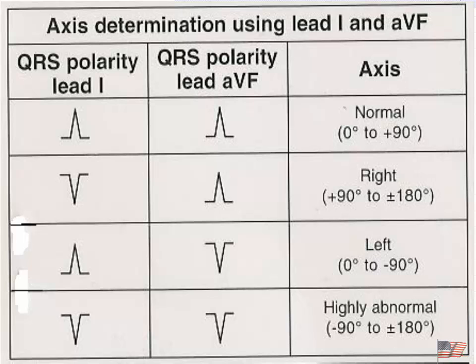That line we're talking about, the way it dips down, it's supposed to go from negative to positive, but it goes backwards. It dips down. Because it's seeing more pull on the right side of the heart, left-sided infarction, right-sided hypertrophy, it's going to move the current in that direction. So therefore, instead of being right to left, it's left to right, giving us a negative deflection.